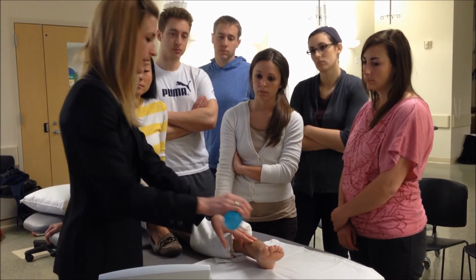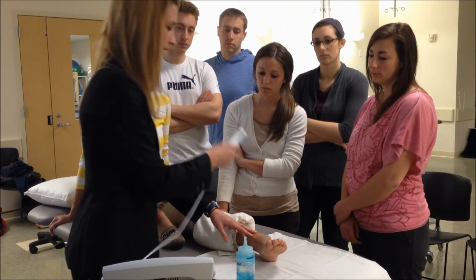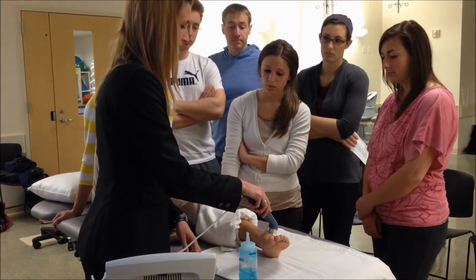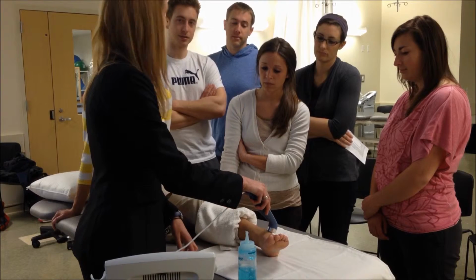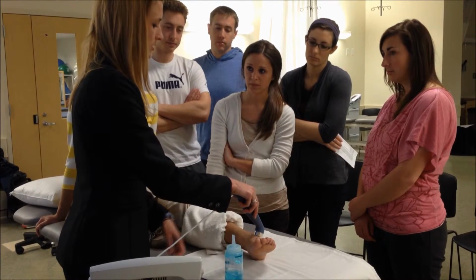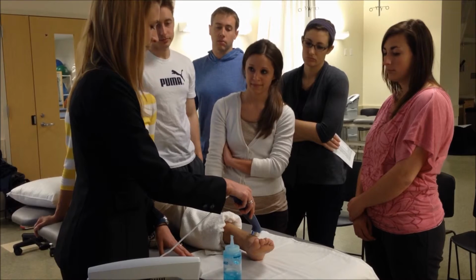Now we're going to apply the gel to the area. A decent amount, but not too much. And then I'm going to place the ultrasound head on the area and press start. So, small little circles. Does anyone remember how many times the size of the ultrasound head? 1.5 to 2. Exactly. And very small circles. Okay, keep it moving. We're kind of close to a bone here at the lateral malleolus. We want to steer clear of that and make sure we're just getting on that ligament. Any questions?